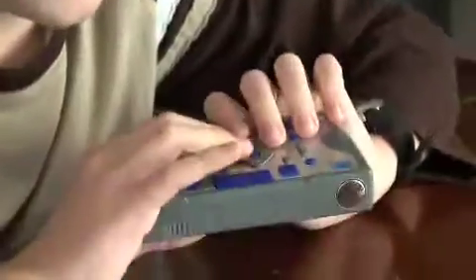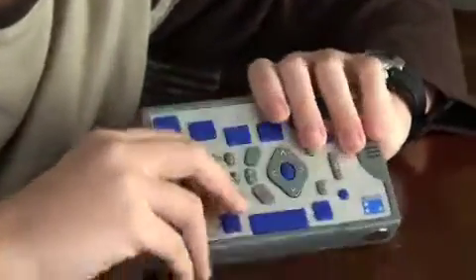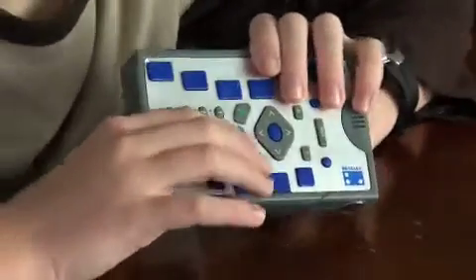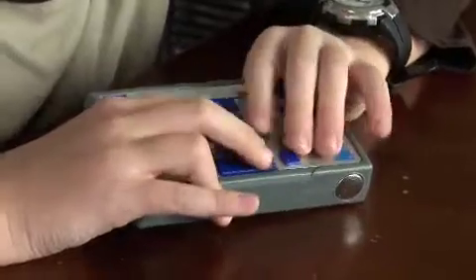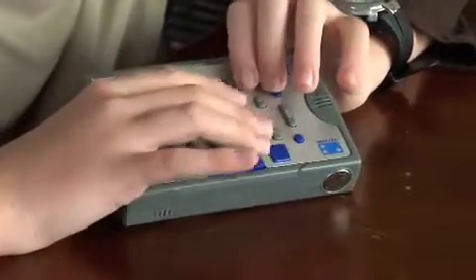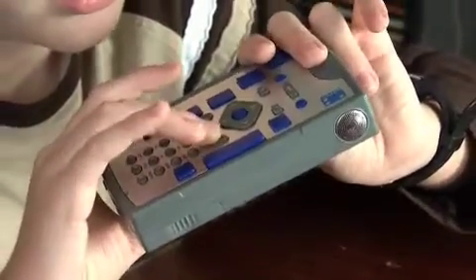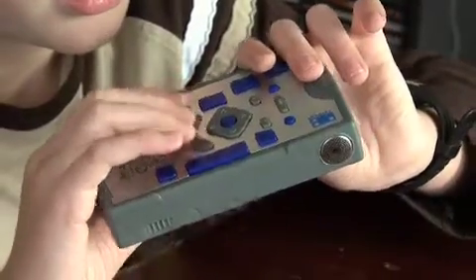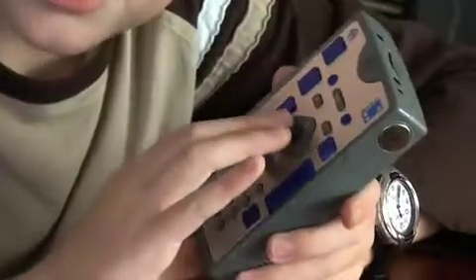I put mine in and it vibrated in my hand, which means it's going to get ready to start up. Then you can put on the back cover. And if it doesn't start talking, you can hold the cancel button, which is the button that is below the diamond-shaped keypad. It's the third key to the right. And you can hold it down, and you should hear. It takes a few seconds before it actually will start talking.